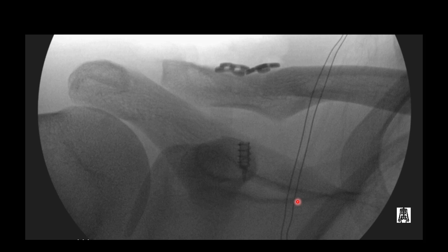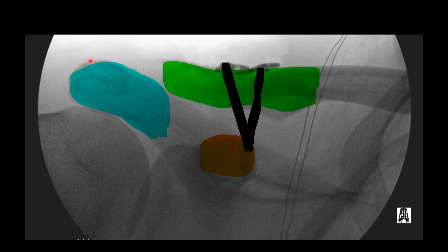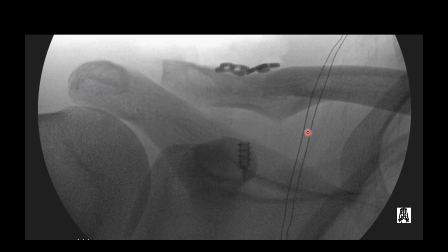Here are some fluoroscopic images of the treatment of AC pathology. I've highlighted the acromion, the clavicle in green, and the coracoid process in orange, as well as indicated the most likely site of the graft. You can also see that the distal portion of the clavicle has been resected. Here it is again without the overlay, so you can appreciate the screw in the coracoid process as well as the surgical hardware holding the graft in place.